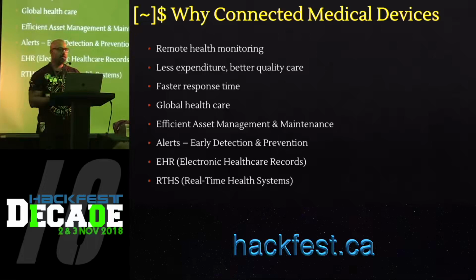As soon as we found out about the maintenance mode, we frantically started Googling to see if there's some sort of manufacturer's guide out there which might expose the default password. And surely there was. So we got the default password, and we tried it, and of course it worked, because you have no idea how much effort goes into changing the default passwords. It's just madness.